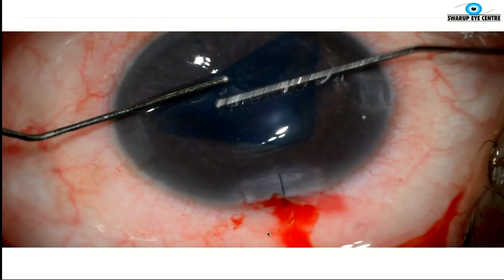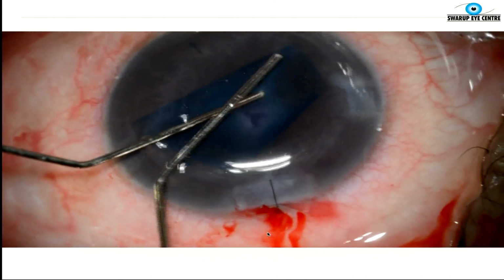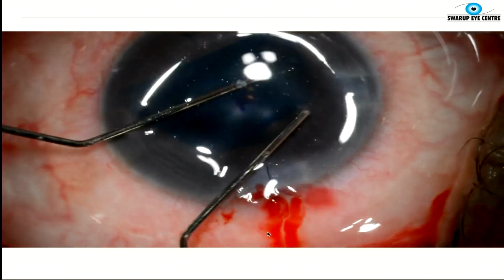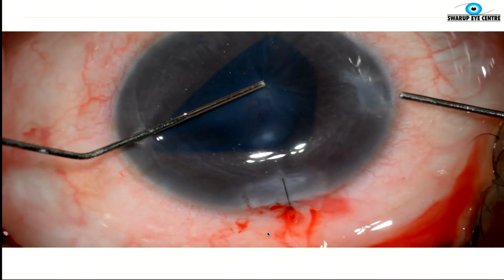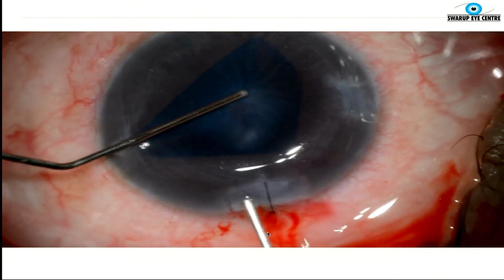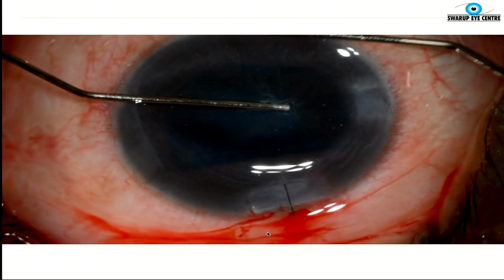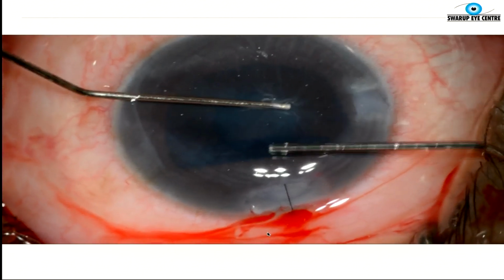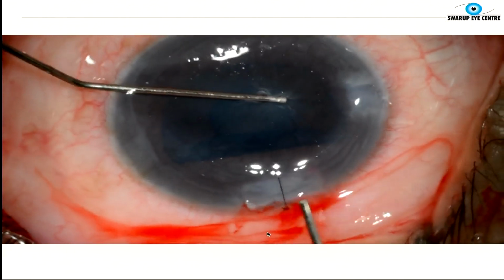This is the one place where DMEK is really different from DSEK. We tend to press more when we're doing DSEK, but in DMEK, this is more like a drumming, kind of gentle taps. And there are techniques of tapping. I'm sure they'll be covered later, so I won't go into the details of those. And then basically, you try to flatten out the entire graft like so, using various tapping and egress maneuvers.